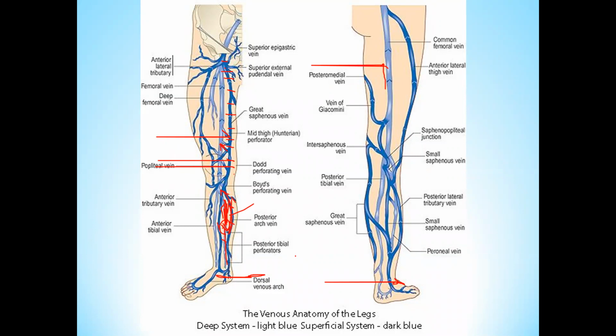You can localize the dorsalis pedis artery by placing the transducer at this region and then proximally following it. This dorsalis pedis artery is actually the continuation of the anterior tibial artery. So the anterior tibial artery can be localized at the anterior aspect just between the tibia and fibula, by palpating it and placing the transducer in short axis.